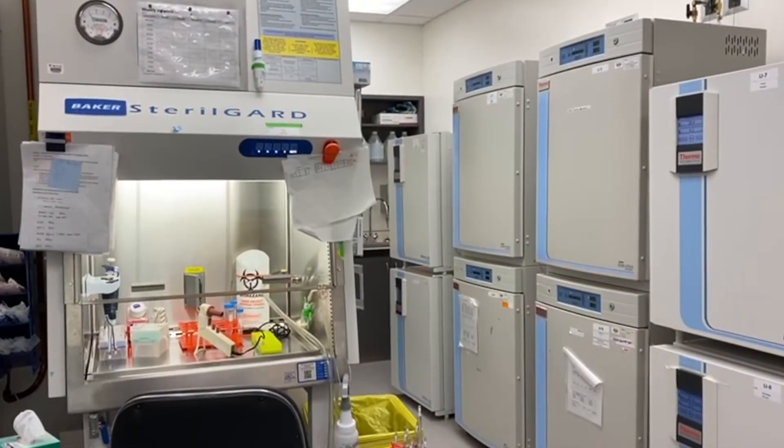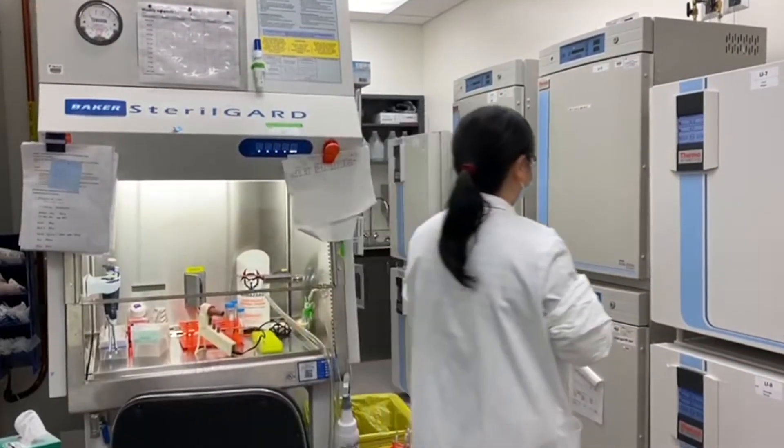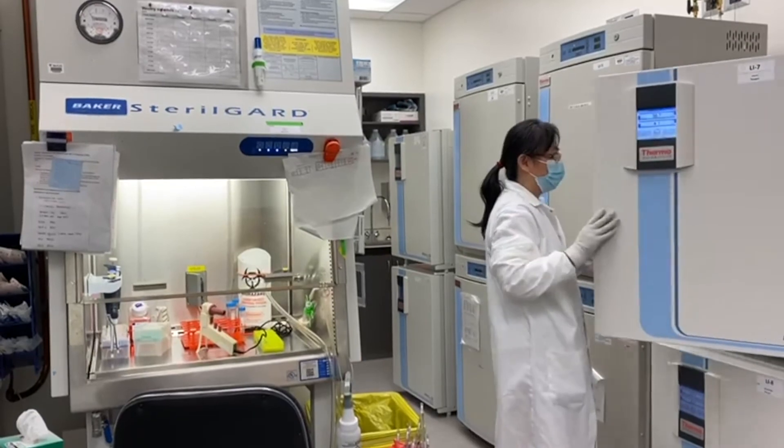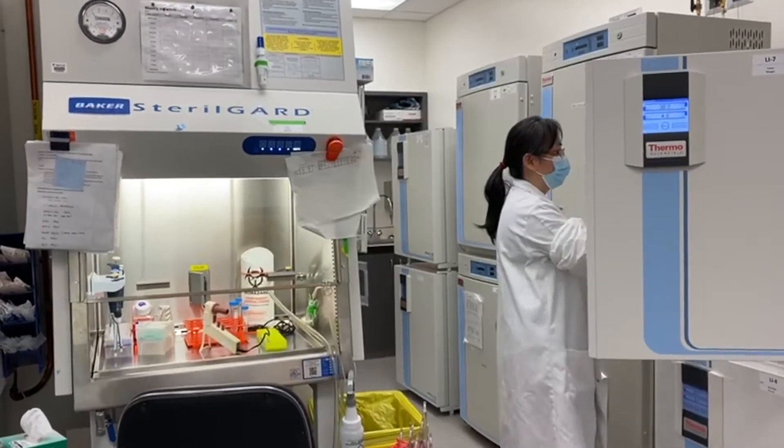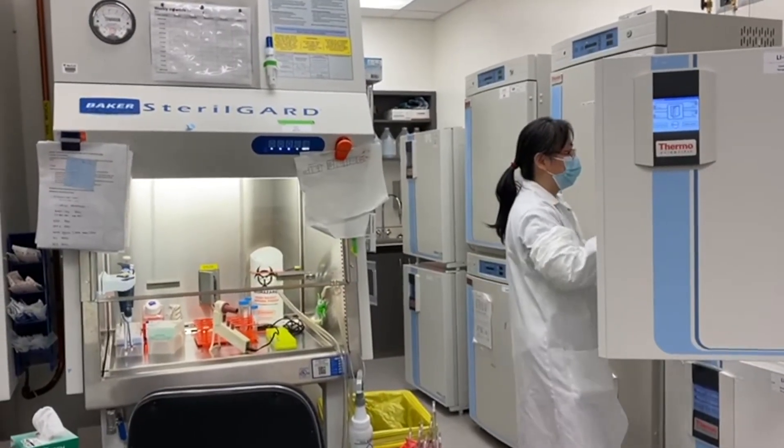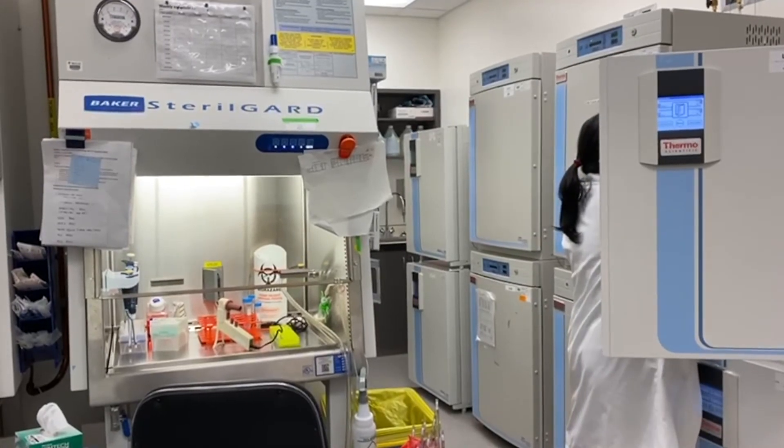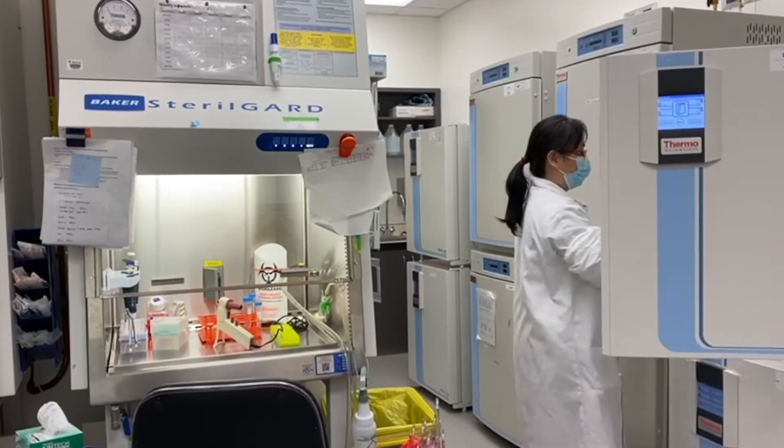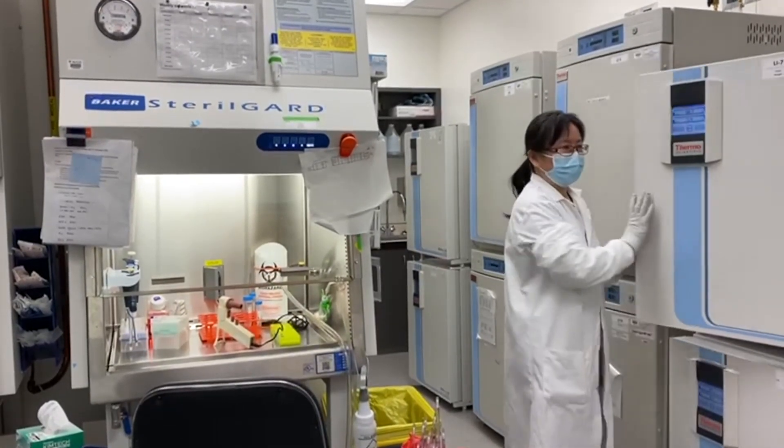Store the dish at 37 degrees Celsius inside the cell culture incubator for at least one hour before using it to plate cells. Ideally, matrigel coated dishes should be used on the day of the coating.